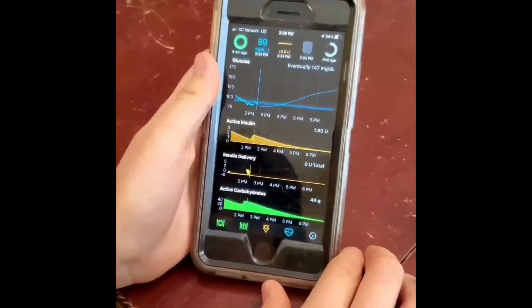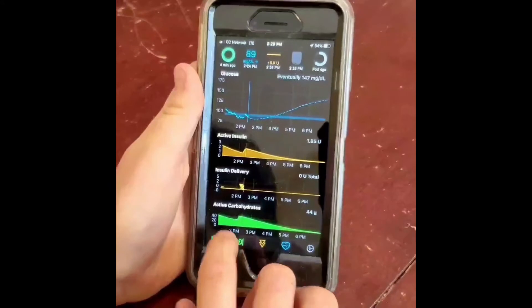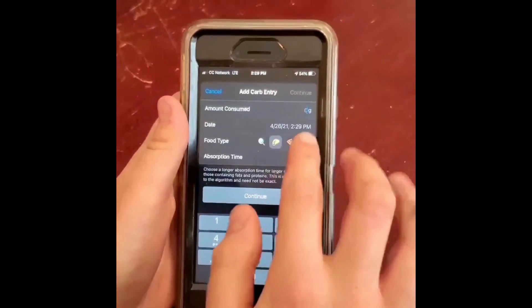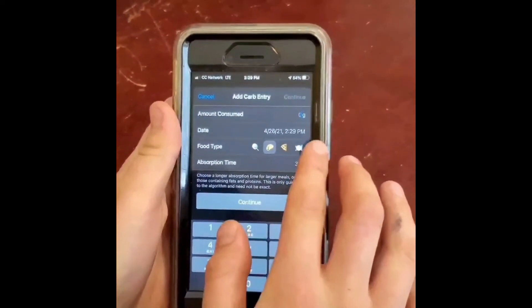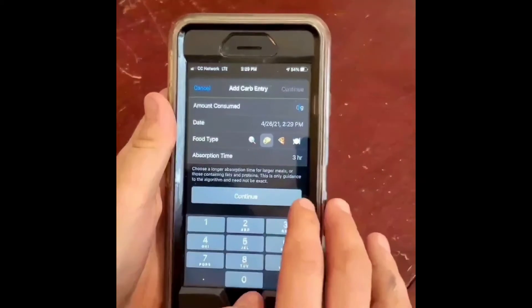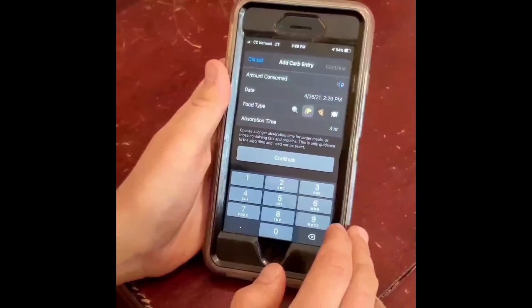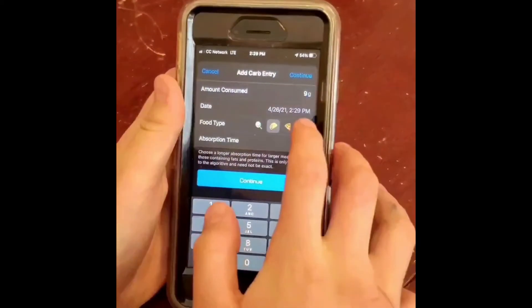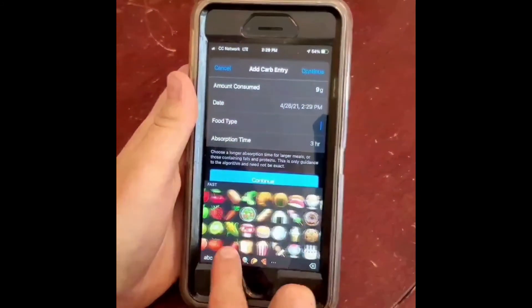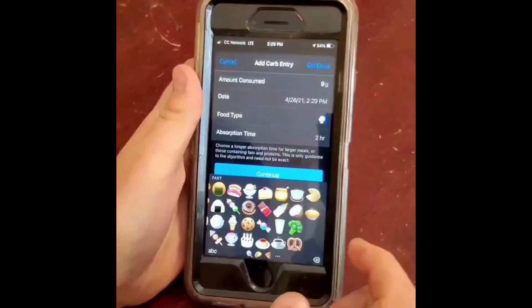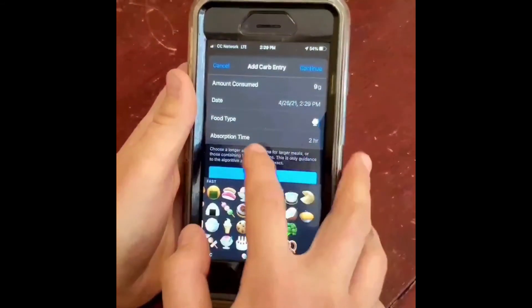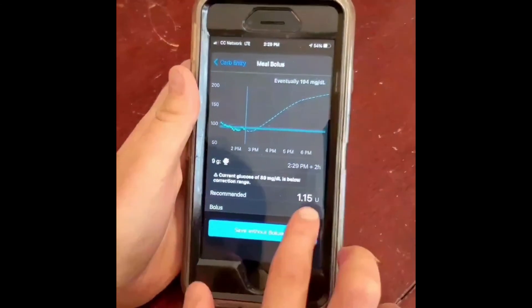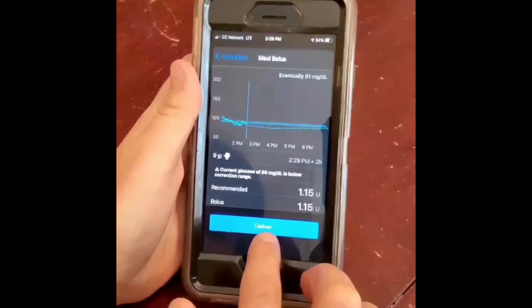Let's do a simple three-step meal entry. First, tap the meal icon on the left side of the toolbar to reveal the add carb entry screen. Add the amount consumed, tap the food type, and tap continue. Who doesn't love ice cream? Let's put in 9 grams. Tap the food type right there to reveal ice cream — it'll be a two-hour absorption time. Then hit continue, and now all you have to do is hit this and deliver.